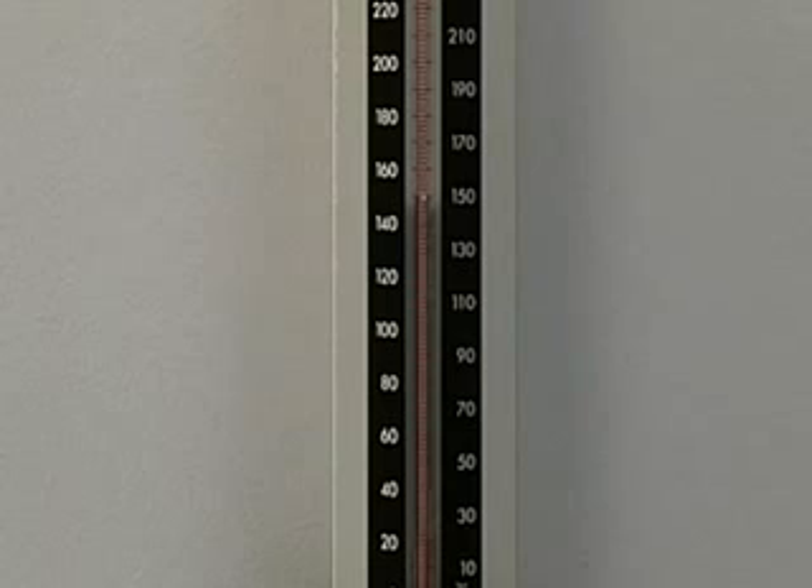Deflate the cuff slowly, less than 5 millimeters per second, until you first hear pulses or Korotkoff sounds. This is the patient's systolic pressure. Keep deflating the cuff until you no longer hear these sounds. This is the patient's diastolic pressure.